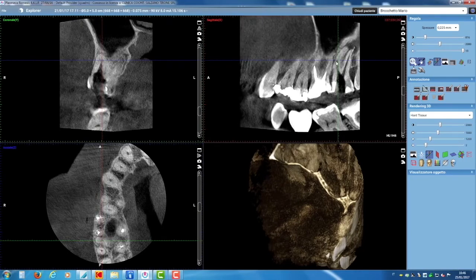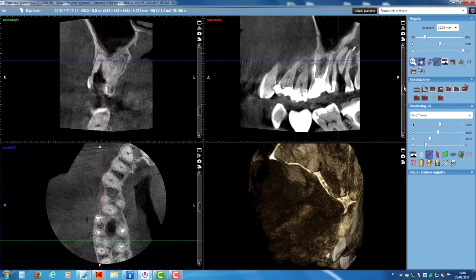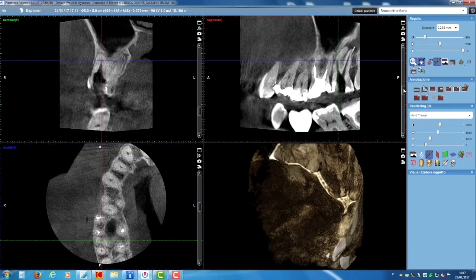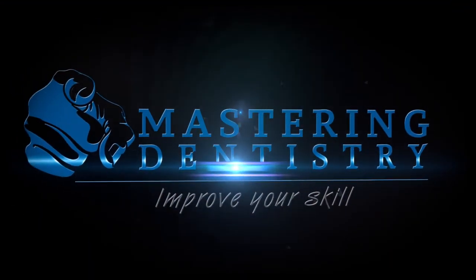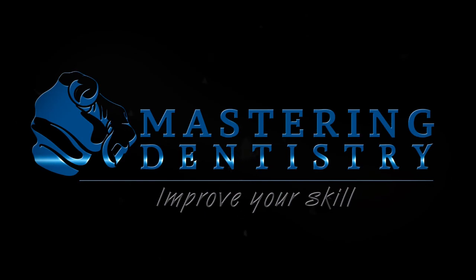Looking at the frontal projections it would seem I nearly got it. The canal was actually near where I was looking for it, on the basis of my experience and intuition. I was aware that having gone towards the mesial surface while perforating, I had to look for the canal towards the distal surface. The trouble with this route is that it bends in the distopalatal direction, so the key to solving the problem is to go one millimeter closer to the distopalatal surface.